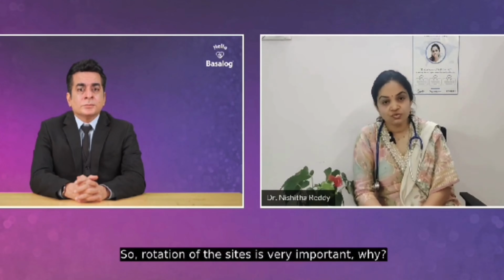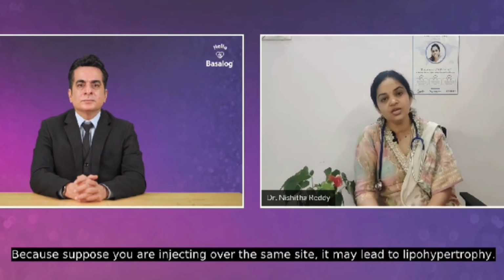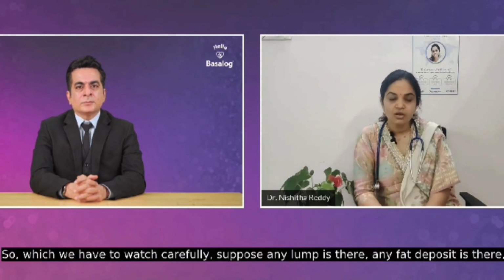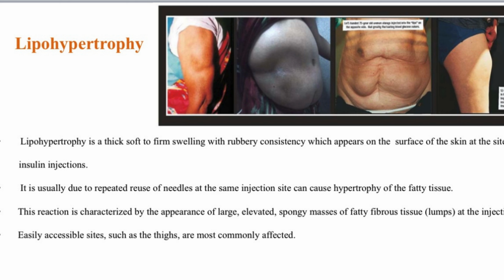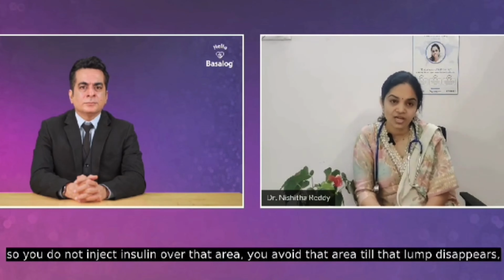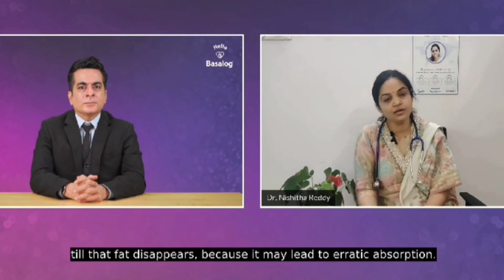Rotation of the sites is very important. Why? Because if you inject over the same site, it may lead to lipohypertrophy, that is, fat deposits, and lumps may form, which we have to watch carefully. If any lump or fat deposit is there, don't inject insulin over that area. Avoid that area till the lump disappears, because it may lead to erratic absorption.